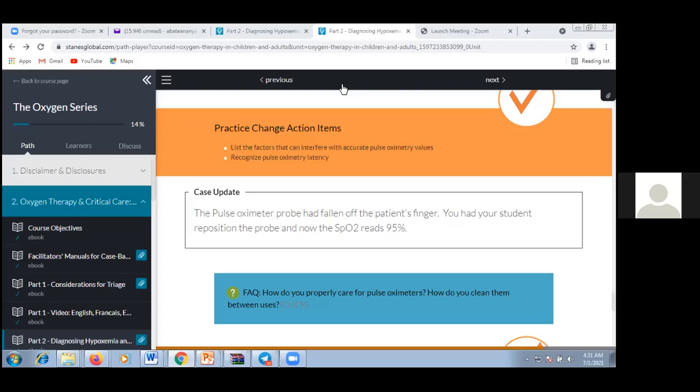And from arterial blood gas, you can know the arterial saturation level, which is much more accurate than the pulse ox reading by itself. But in a setup where you don't have ABG analysis and pulse ox is not working, then you have to rely on your clinical judgment to know if the patient is hypoxemic or not, like having higher respiratory rates, patients in respiratory distress, or pathologies that would otherwise suggest the patient could be hypoxemic, like absent breathing or gasping kind of breathing.